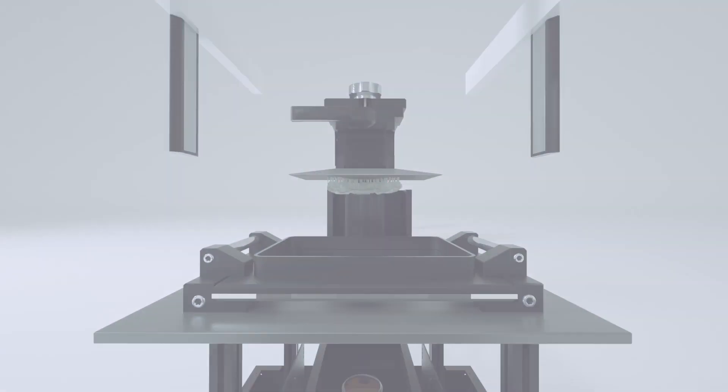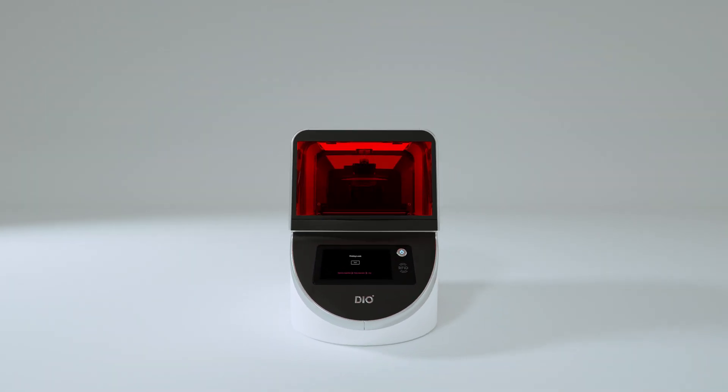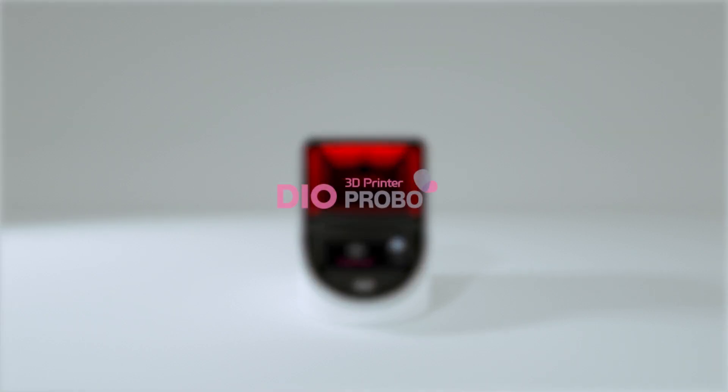We create a new standard of dental 3D printing while enhancing design and function. We deliver more than a product — we deliver the value. DIO PROBO.